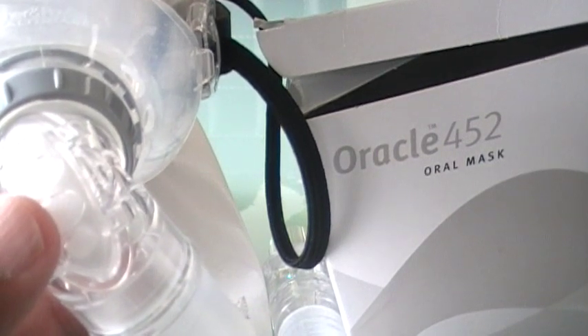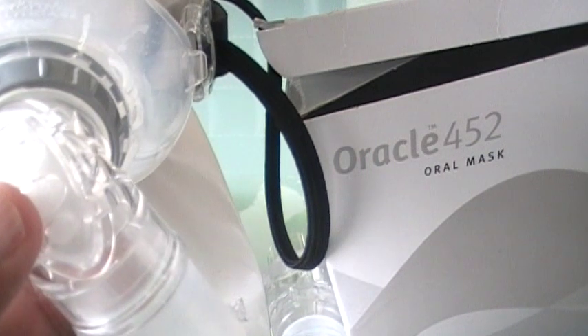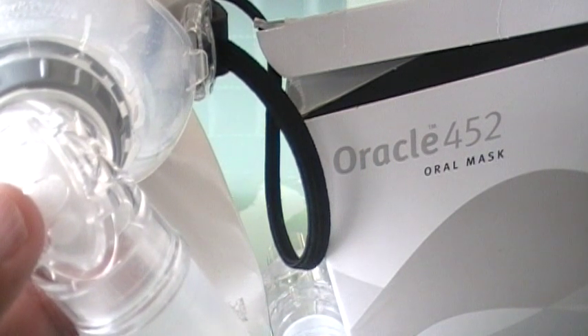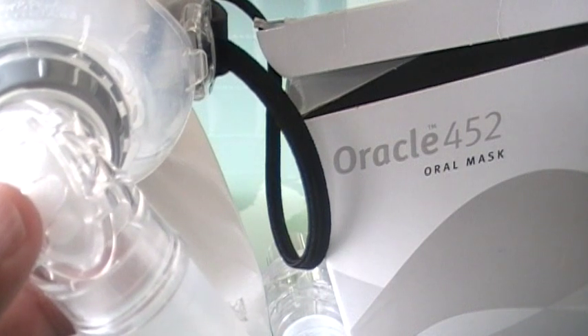Welcome back to cpaphelpdesk.com. This is a video review for the oral CPAP mask called the Oracle 452, made by Fisher and Paykel.